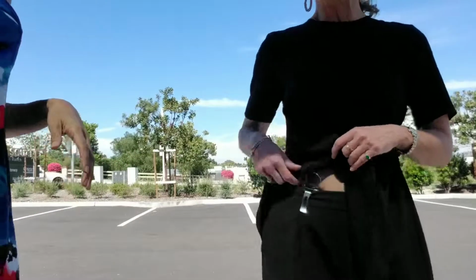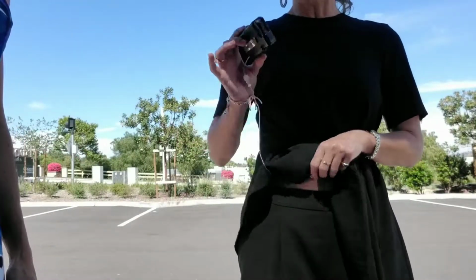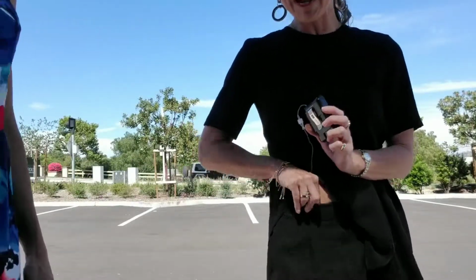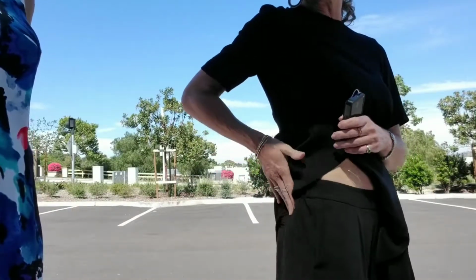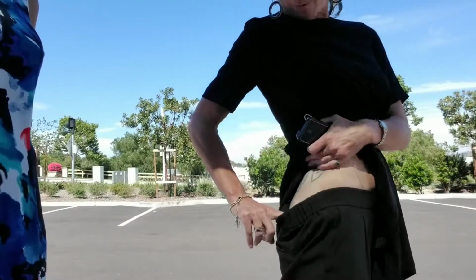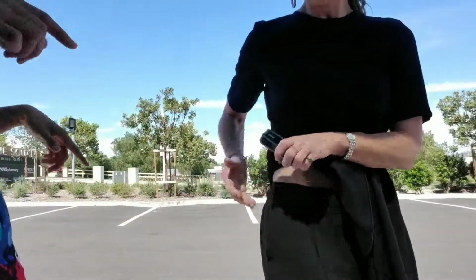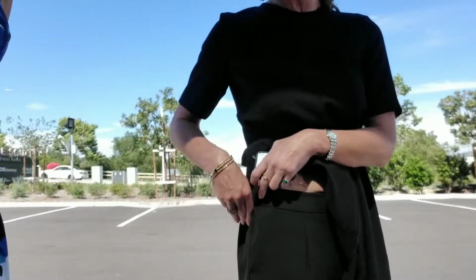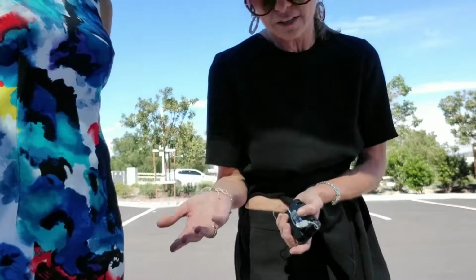Okay. So my pump is sitting on my waistband right now. The pump and the tubing are just tucked away in my bottoms, which doesn't bother me. I don't feel it or anything. My infusion set right now is right on my rump, so right there. X-rated. So if I was at the beach, I could disconnect and my bathing suit bottoms would cover it and nobody would see anything or ask questions if that concerns you.